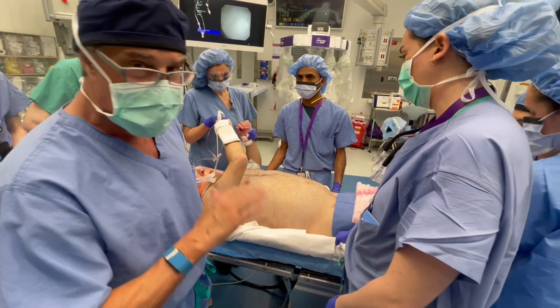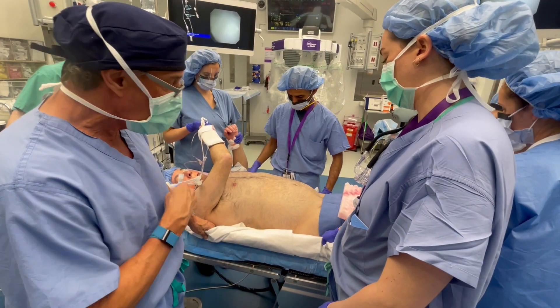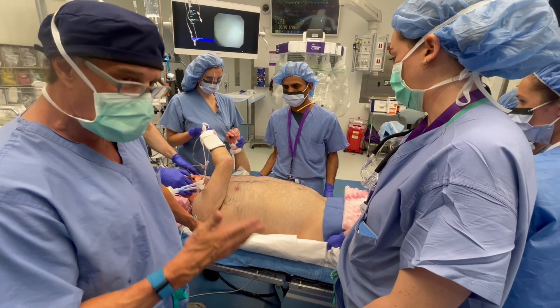Watch how we do it quickly. No beanbag — total waste of time. No armboard, no A-line, no type of cross, no type of screen, no nonsense.